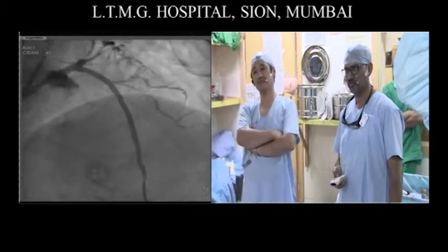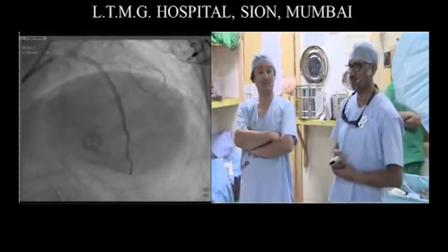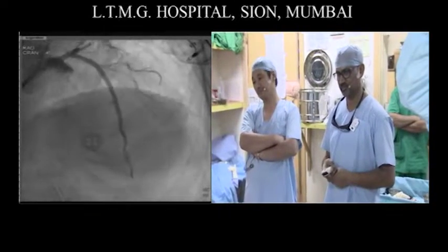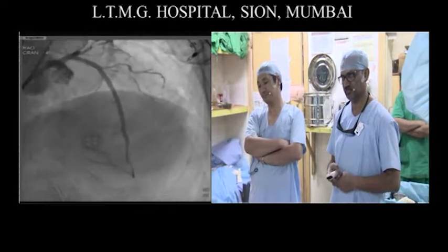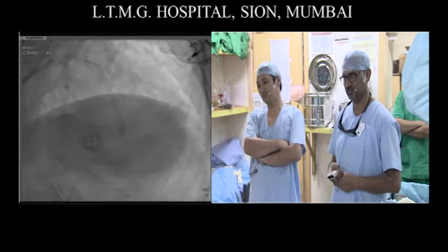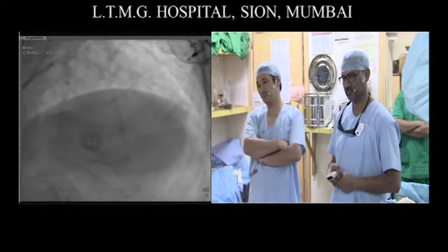Can I answer this question? Yes, anyone. I think this is not only the drug. This is the kinetics of the drug. This is the polymer. This is the stent. There are a few factors which play a role. And we've already seen the randomized trial in which we compared my stent, a new sirolimus-eluting stent, with a Xience stent.